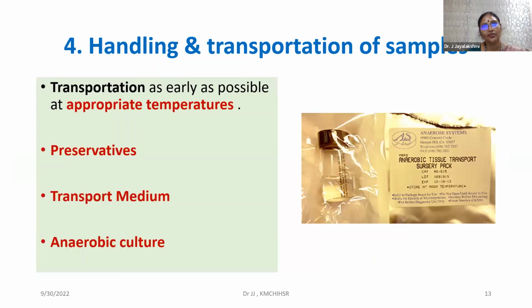So you need to transport the sample. I think this is just an extension of the sample collection. Collected samples need to be packed and transported appropriately in containers that have a biohazard symbol on them, right? So this transportation, as a variable, you would see not being done in appropriate conditions. And sometimes they will say, ma'am, we always use it, it's just that today we didn't have it. Or sometimes they will be using it that day only, so they have no clue on how to put it, so they just drop the sample inside like that.